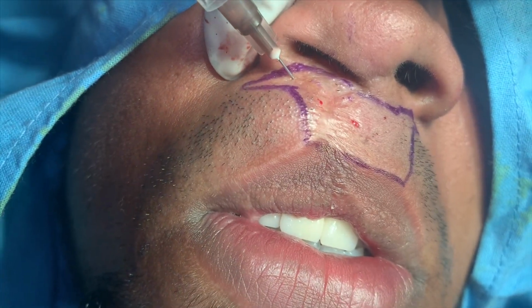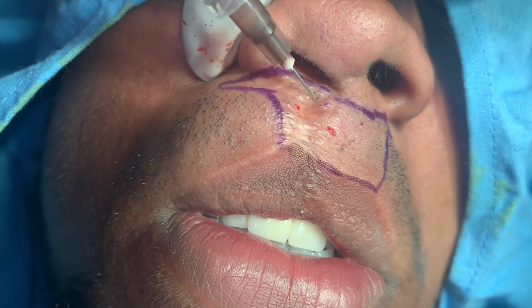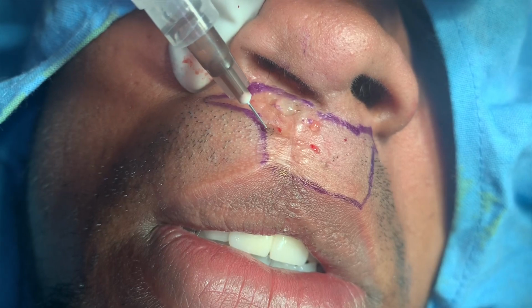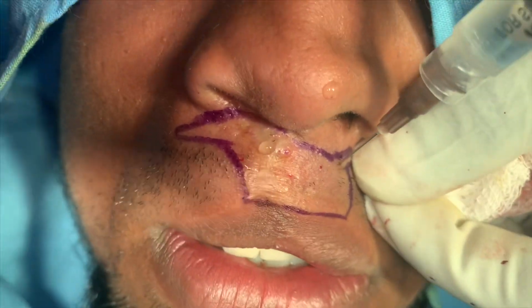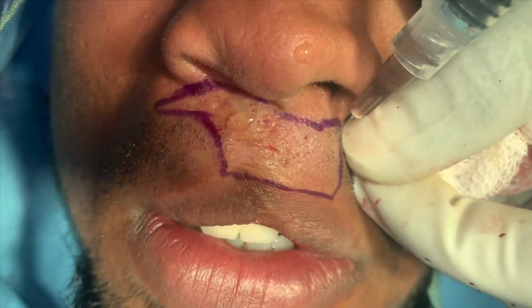So I've already given him a block. We've given injection at the base. Now we're giving the tumescent before you can make the slits. This is needed to make the lip tense, and the slitting and insertion technique is also going to be different. We'll see that in a while.